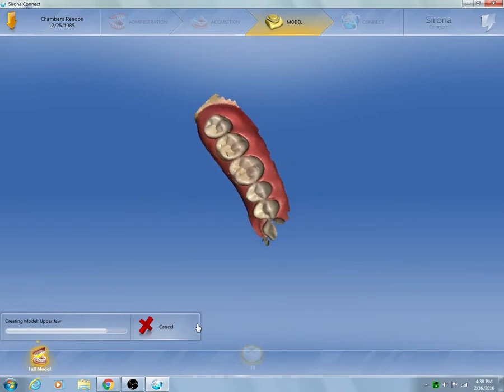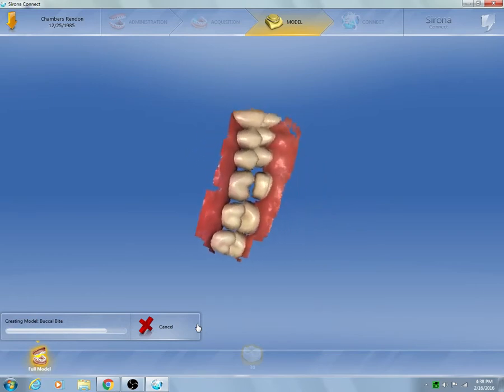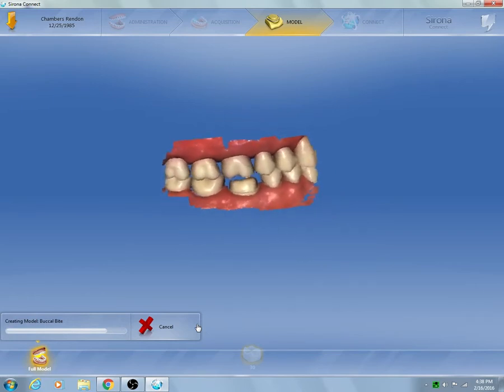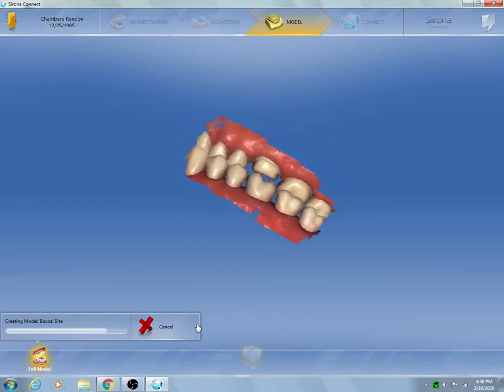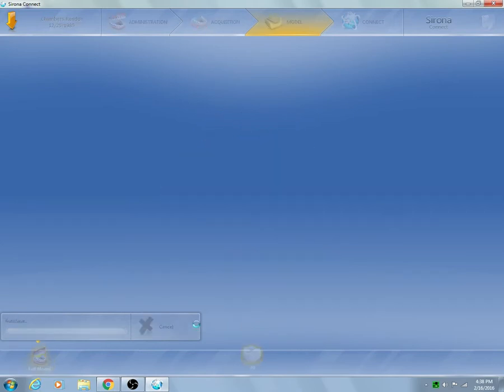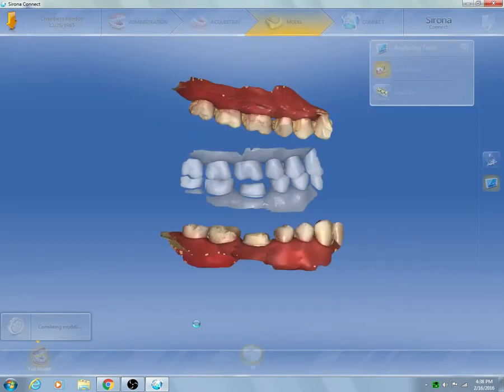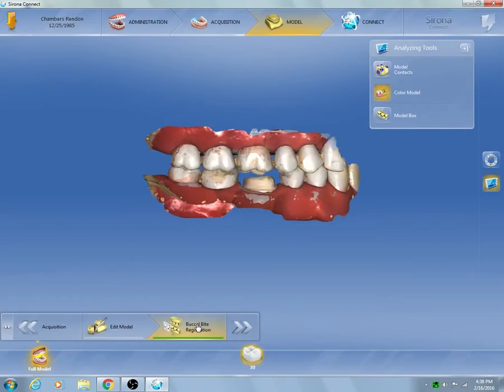At this stage we're finishing the creation of the lower and upper jaw models. We're now creating the buccal bite virtual model, which we'll utilize to stitch to the upper and lower jaw to find the patient's occlusal height of the prepped area. The new software will now automatically stitch the buccal bite for you if you acquired enough information during the buccal bite scan — getting enough gingival area and tooth sections before and after the prepped area.